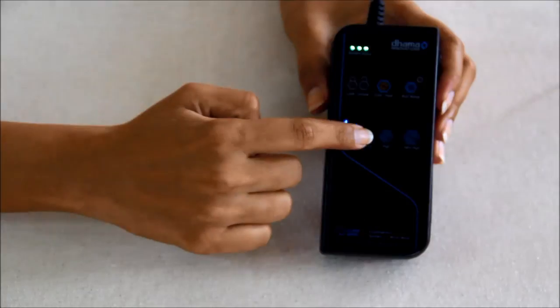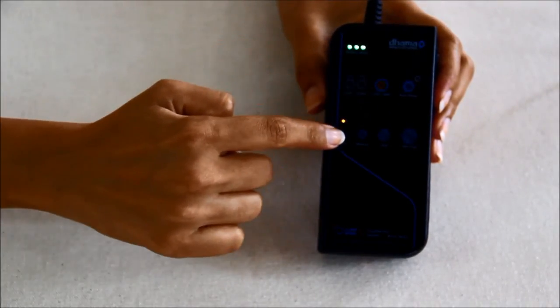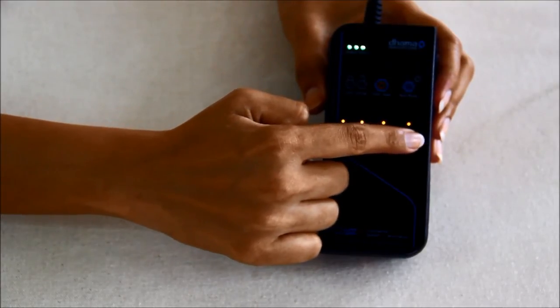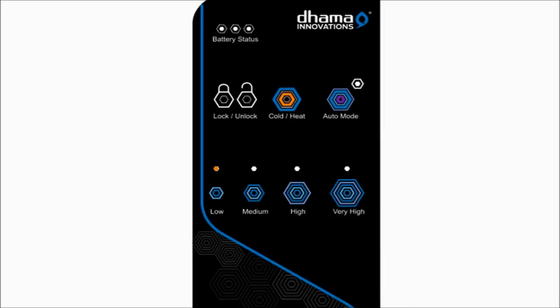Touch the desired level to activate it. In all four levels, the cooling mode is indicated with blue LEDs and the heating mode is indicated with amber or orange LEDs. The four levels are: Low — the lowest level of cooling, heating, and contrast therapy; Medium — the medium level; High — the high level; and Very High — the very high level of cooling, heating, and contrast therapy.